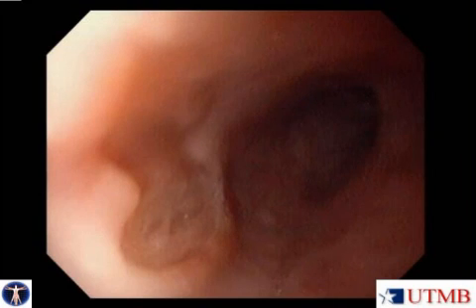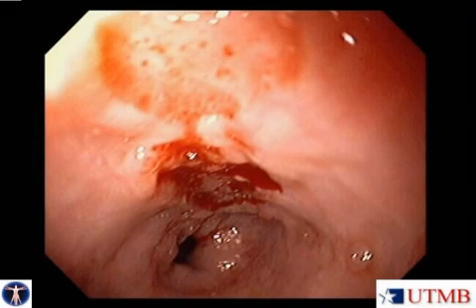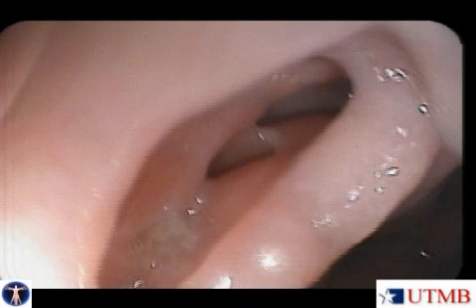This patient had undergone multiple previous endoscopies to evaluate similar complaints. Each endoscopy revealed single or multiple ulcerations in the distal esophagus. Biopsies from these ulcerations consistently were negative for viral cytopathological changes or fungal elements. The end result of these multiple and frequent ulcerations was the development of the pseudodiverticulum noted on his current endoscopy.